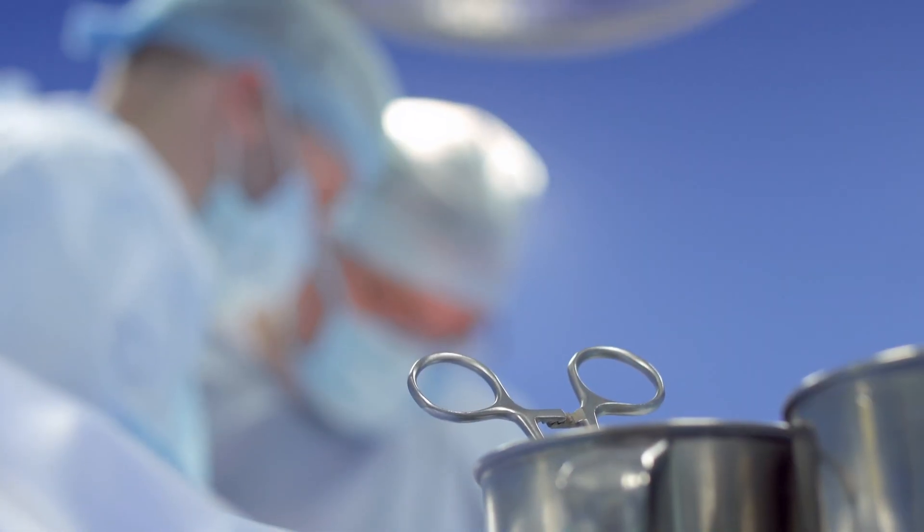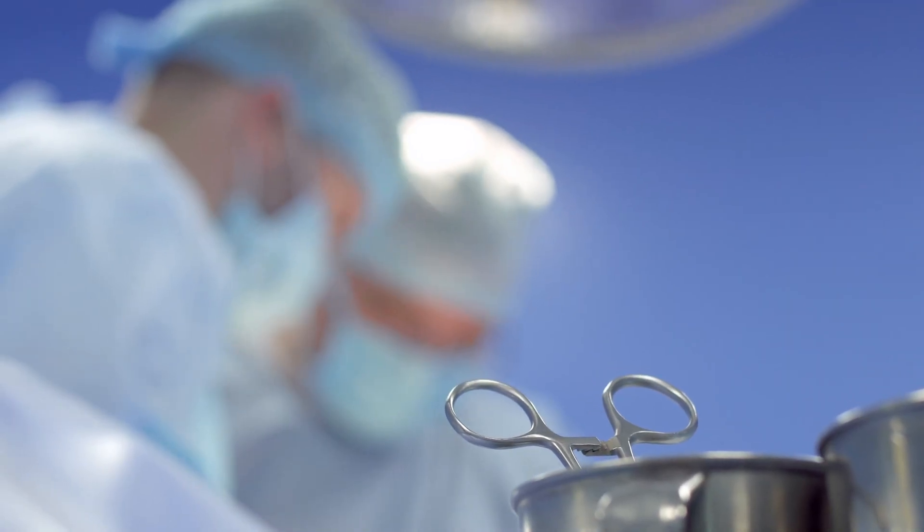How do you do a two-handed tie? This is one of the most basic techniques in surgery, whether you're a nurse, a medical student, a surgical resident — anybody that ties a knot needs to know how to do it right. So today we're gonna do a quick video on how to do a two-handed tie. Let's go.